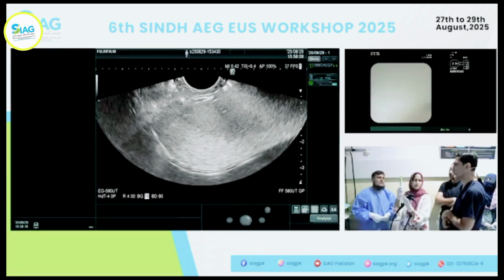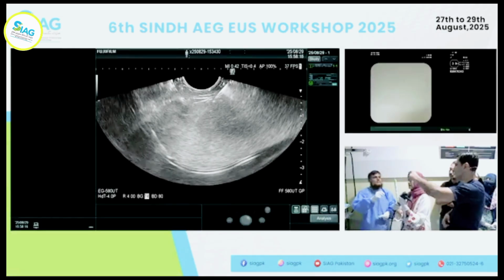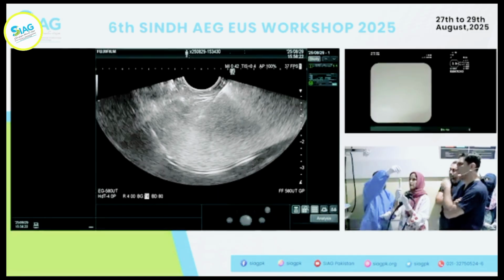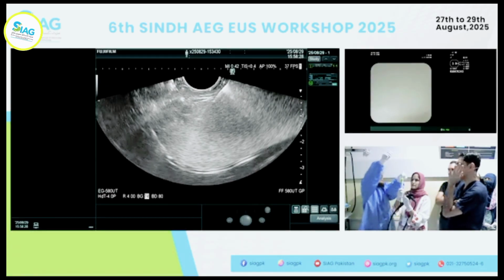No, no, no. You don't take it down. Good. All the way in. Good. Okay. Now you can do it. So you can either do a slow pull or you can take this out. Take it out, please. And you can do a slow pull. You keep out. Good. Well done. In. Out. 1, 3 times. That's brilliant. That's enough.